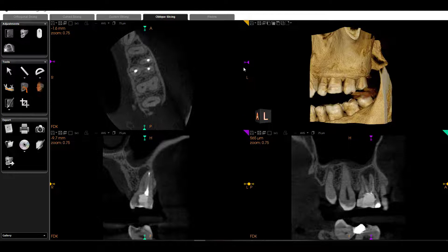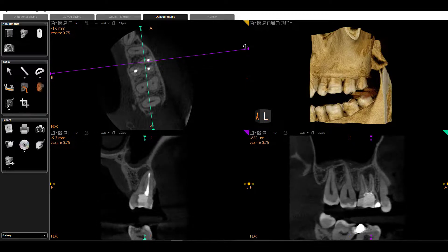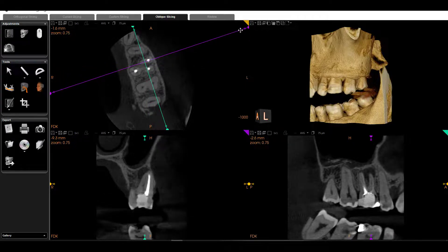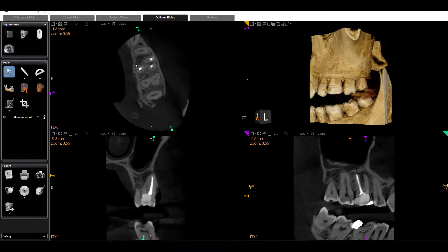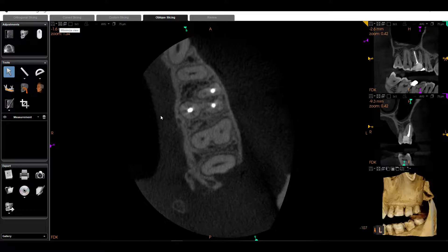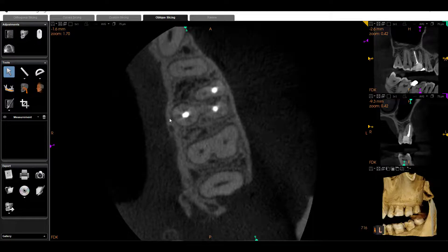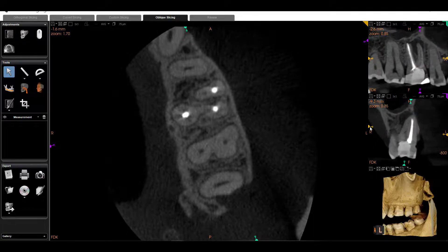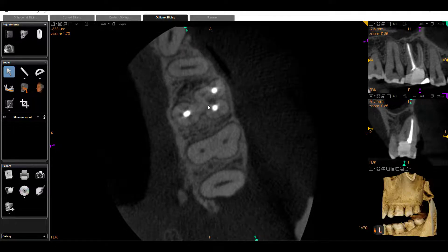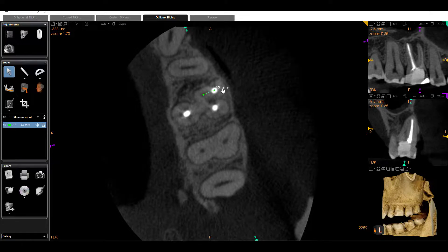Now we're going to change the angle. We're going to grab our coronal slice and change the angle to the long axis of this tooth, and even the long axis of the MB and MB2 roots. We can also maximize this view a little bit further — we can actually see the orientation of where we are on this root. Let's scroll coronally, and where I first begin to see my MB2, I can take a measurement from this known area to where my MB2 actually is.